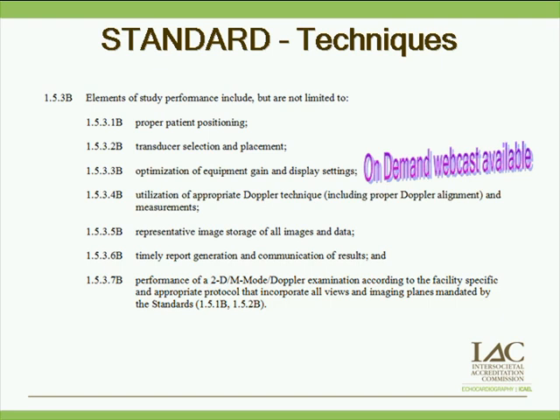Okay, and I like to point out here that if you image something, let's say you have a technically difficult patient and you try to get a subcostal image and you just can't do it, please do yourself a favor. Go ahead, take an image and label it. It's a nice thing for the physician to see that the sonographer was there, they attempted it, it was nothing but a snowstorm. You couldn't see it. So we have a saying here in the office that if we don't see it, it didn't happen. Okay, so again, go ahead and document.